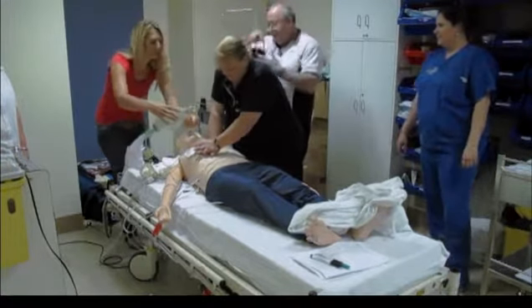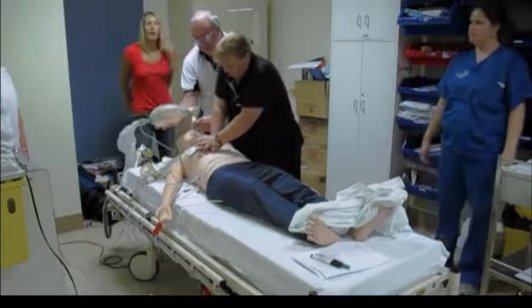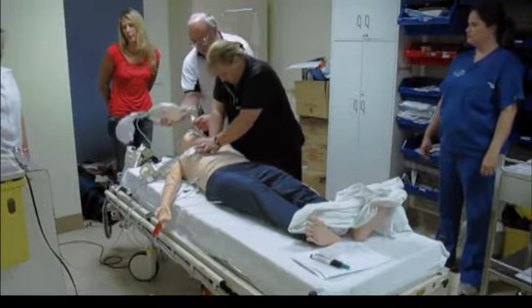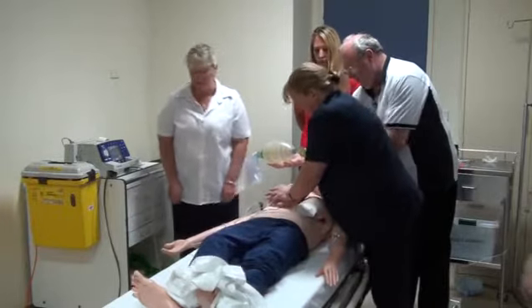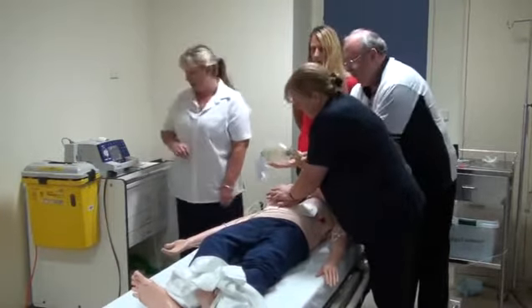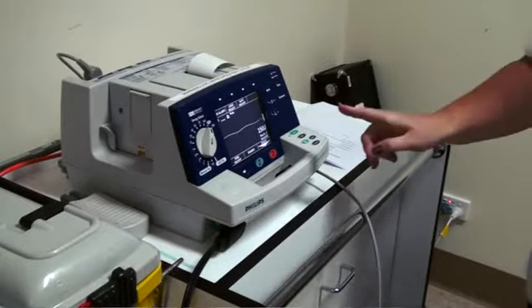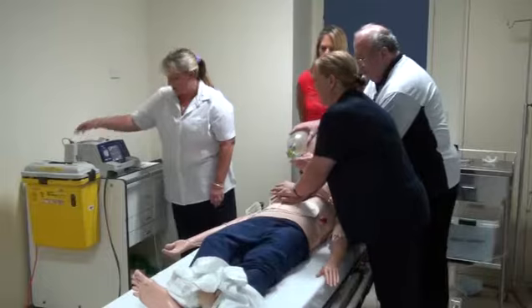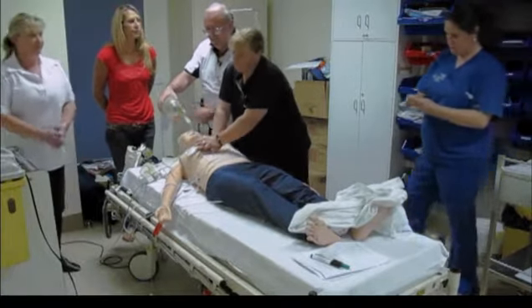Okay, I'll get you to take over the airway. Breathing. Okay, so now we're coming to the end of the second cycle, so we're at 1 minute and 45 seconds since defibrillation. I'm going to charge, I'm at 150. Charging everybody, charging, stand clear. We have asystole, I'm going to disarm. I'm going to check that my leads are in and I'm on the right pads, and I'm happy that we have asystole. I'll get adrenaline, if you like, 1 milligram.